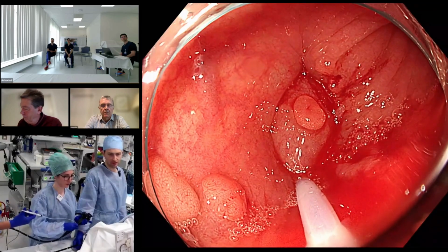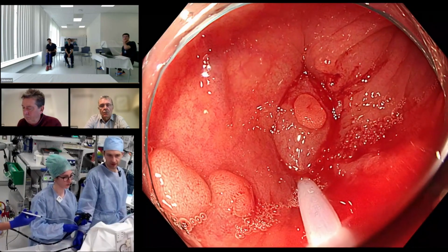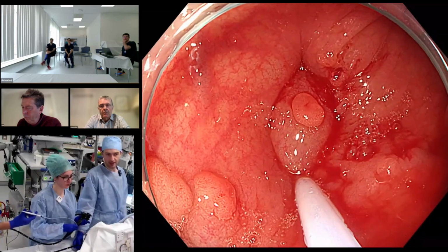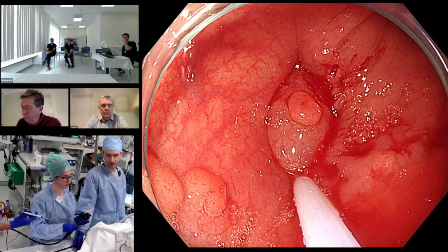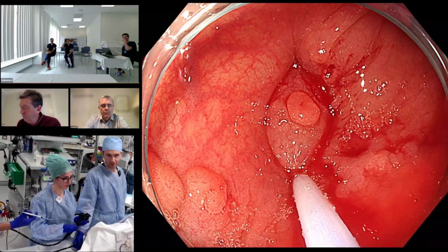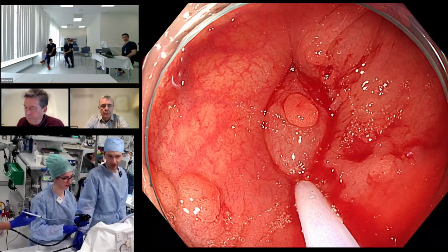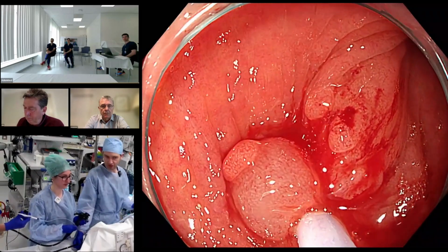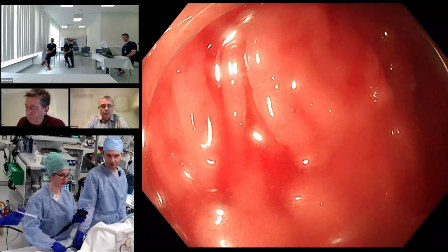So this is one of the things you can do with cold snare polypectomy, right? You can push the snare out very hard, not like push it through the wall hard, but quite hard, and this will get captured because the snare wire is thin. This will not work with a hot snare. It will just scrape over the surface of the tissue. So push it a little bit more. You see you're almost doing a cheese wire effect. You can see the shape of the snare is embedding into the wall of the colon. And now close it quickly. See? With a great margin, right? Unlike what you were doing before, which was a hot snare technique, you did a proper cold snare technique there.